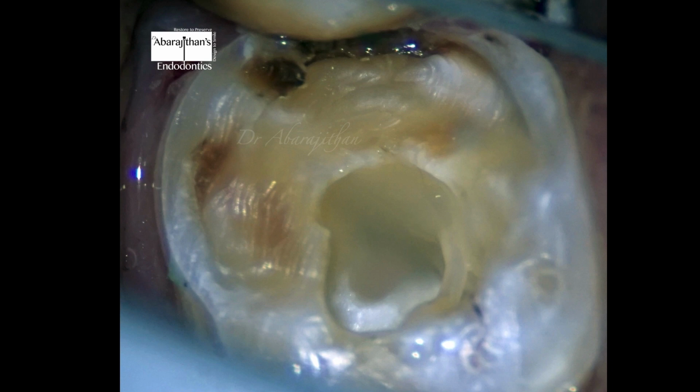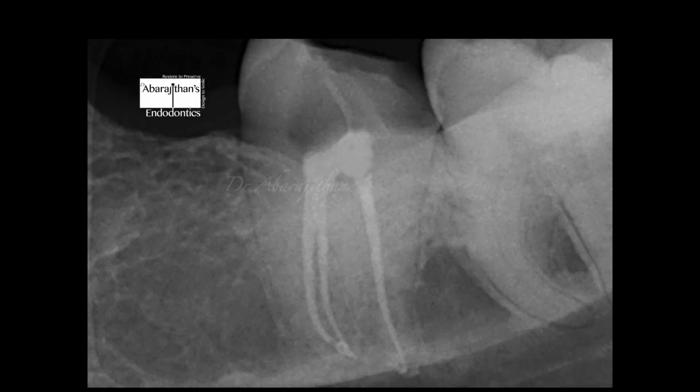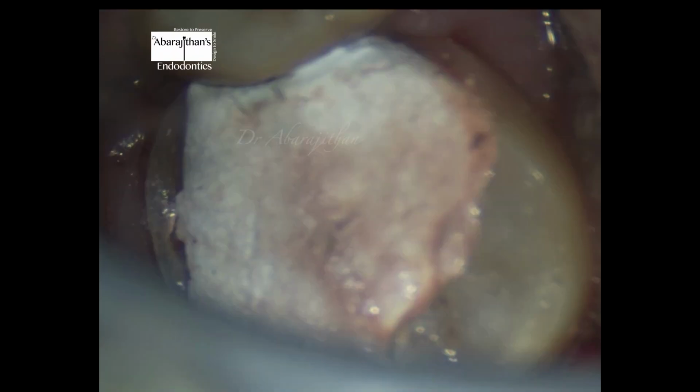And after I had given my coronal seal with the flowable composite, now I can remove the rubber dam and remove the left-behind caries and any gingivectomy or deep margin elevation if needed, give the temporary and send the patient off. So this case has three canals which could have been easily missed if not for the logical understanding of the anatomy and magnification in the clinical scenario. With the same workflow, we temporized at this visit, but we still provided a good orifice seal.